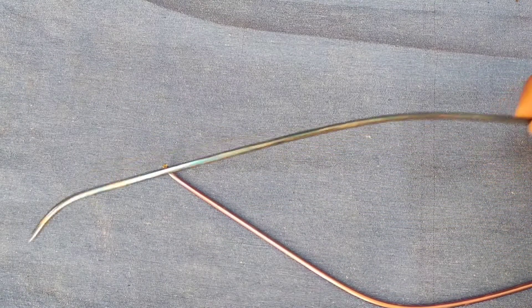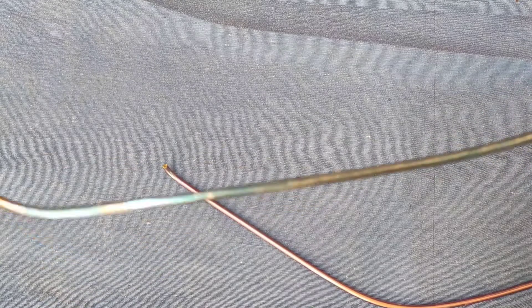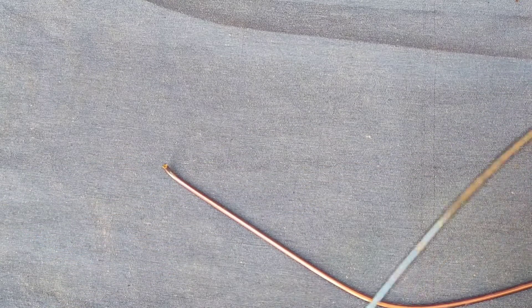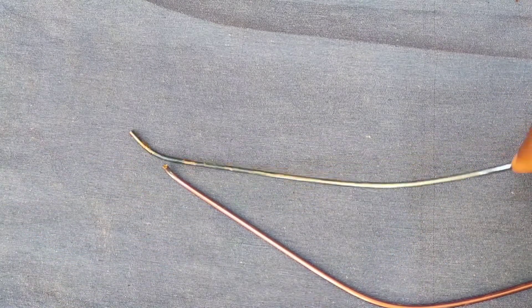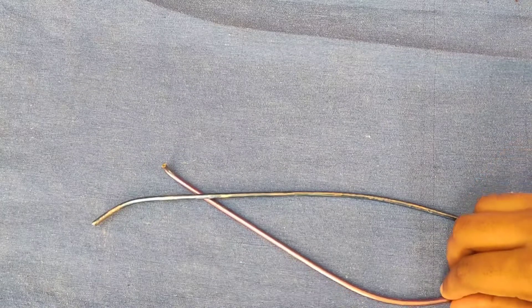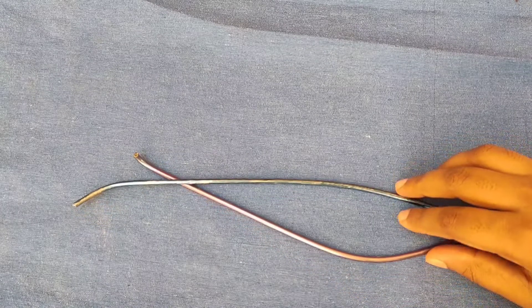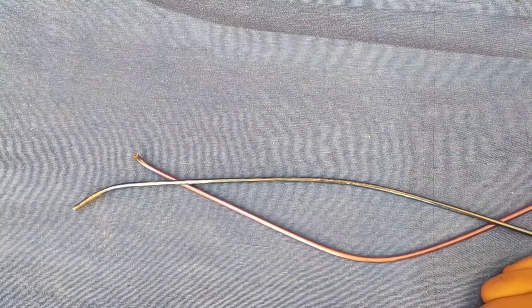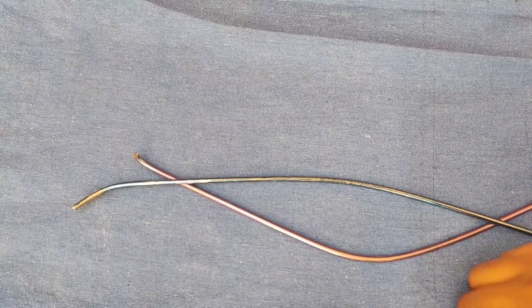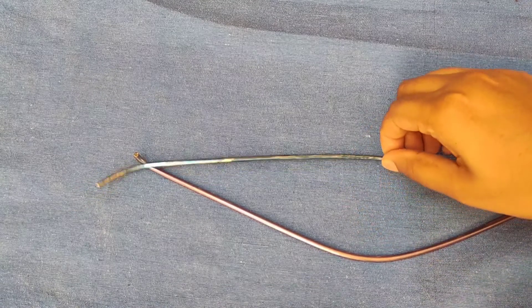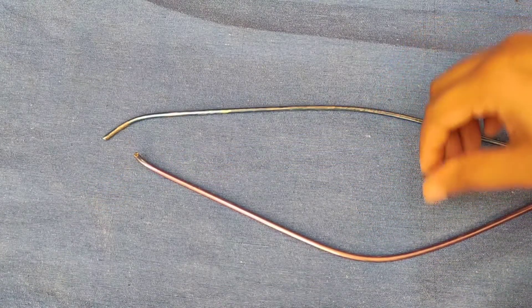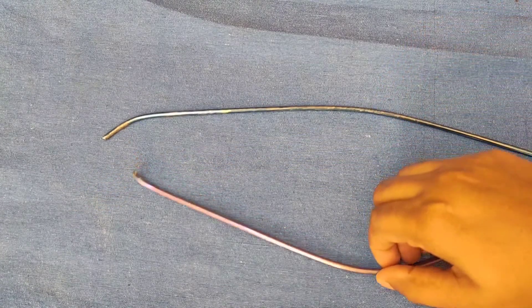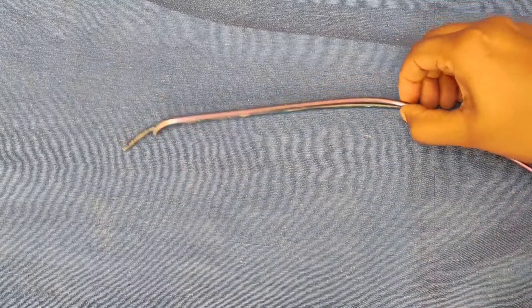It is a nail based on three point fixation. The nail should occupy 30 to 40% of medullary cavity. The diameter of the nail is calculated based on Flynn's formula, which is width of narrowest point of the medullary cavity times 0.4. Commonly available sizes are 2 to 4.5 mm diameter of various lengths.